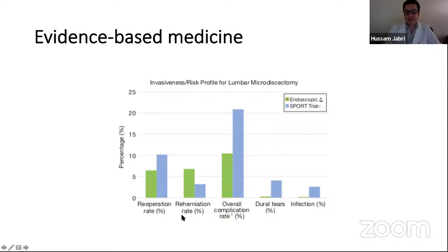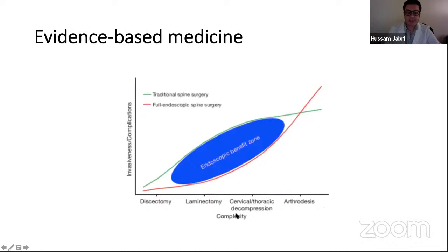Yet it has a higher herniation rate, but these small herniations are more or less remodeling rather than a surgery needed, because the reoperation rate is less. So we have residual disc, but this did not require reoperation in most of the cases.